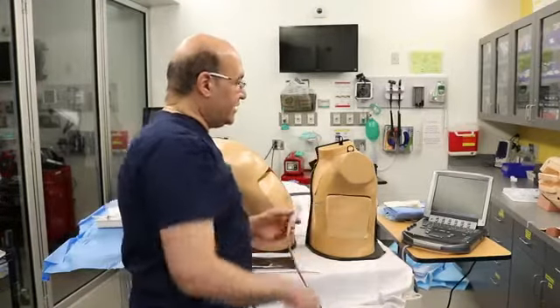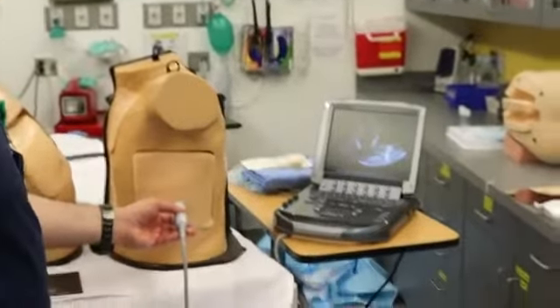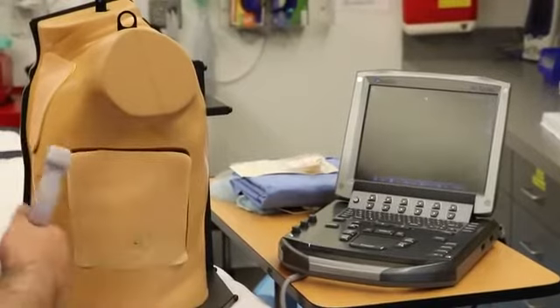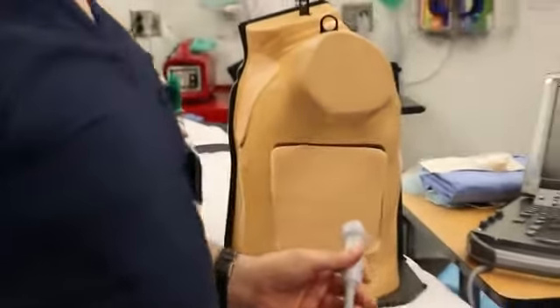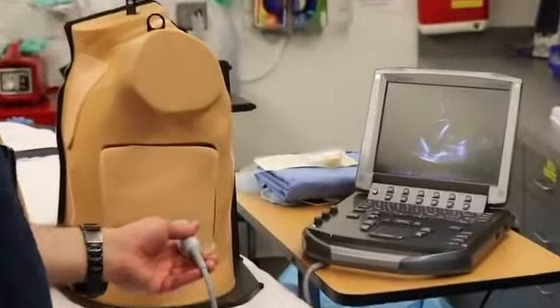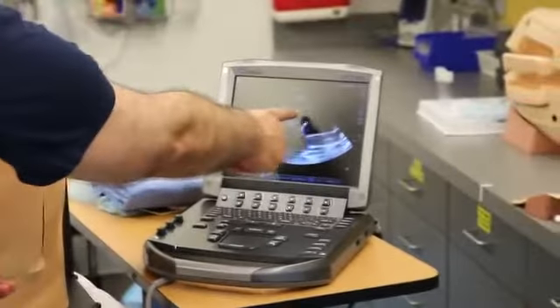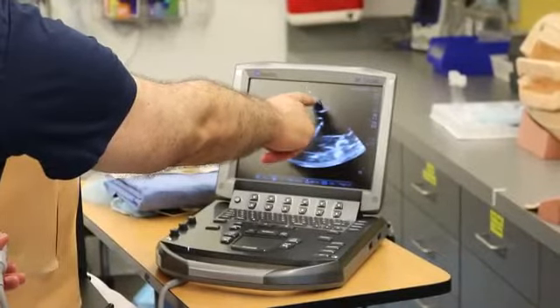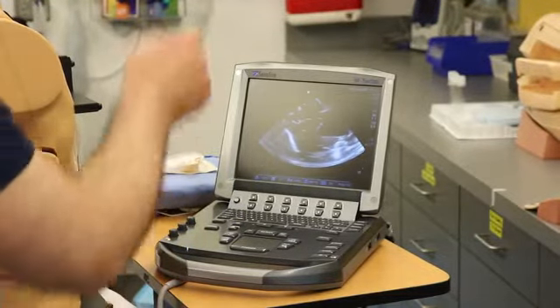Let's look at the screen here. When I put my probe here, I will try to find my diaphragm, here or on the back. For the other mannequin, we can look on the back. And you need to scan your patient's area if your patient has loculated effusion to find what's the best spot to go. If I look here, this looks like my lung. Here is my lung, looks tongue shaped. This is my probe skin here. This white line is the pleura. This white curved thing looks like an inverted V, it is my rib and has a black shadow beyond it.